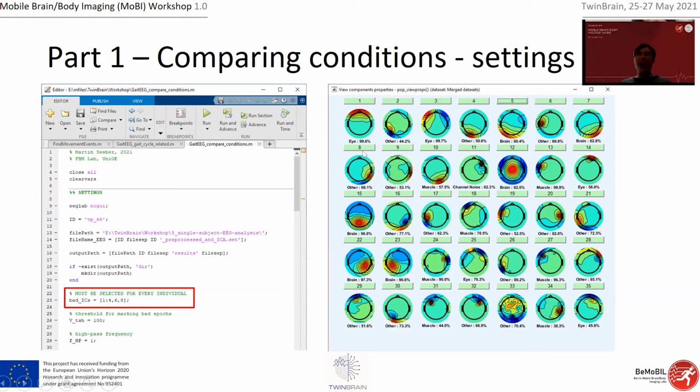That's somehow a bit on the conservative side. I kick out everything that I'm quite confident it's not. And here, I'm also quite sure that this is some kind of brain activity. That's always the thing, right? There might be some brain activity in most noise, but even if you remove something that contains only a little brain activity, you always lose a bit. That's somehow the trade-off. We don't have a clear answer for now, but this is what I'm doing.